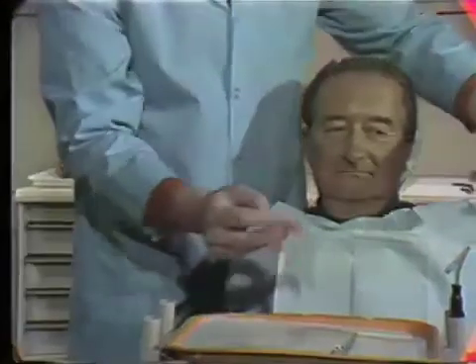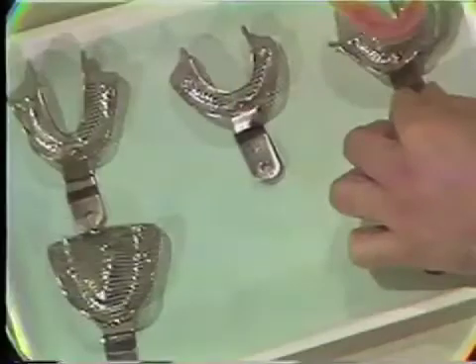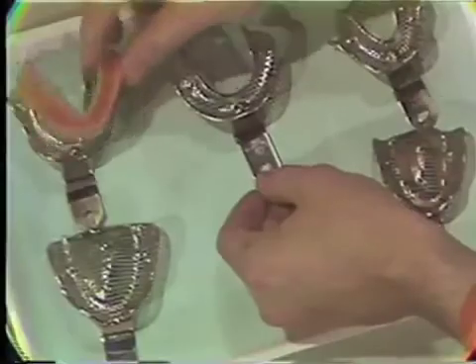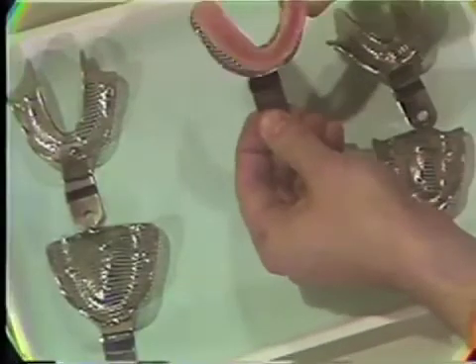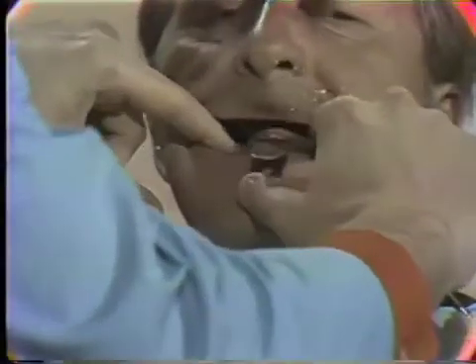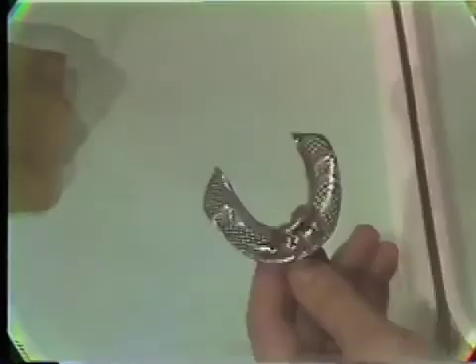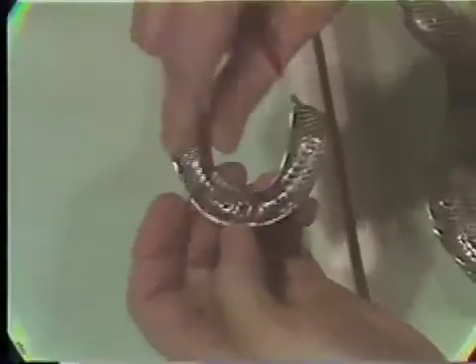The mandibular denture is used similarly as an aid in selecting the proper mandibular tray. The appropriate tray is tried in the mouth to check possible impingements. It is then modified with red rope utility wax as needed — in this case, the distolingual flange area.